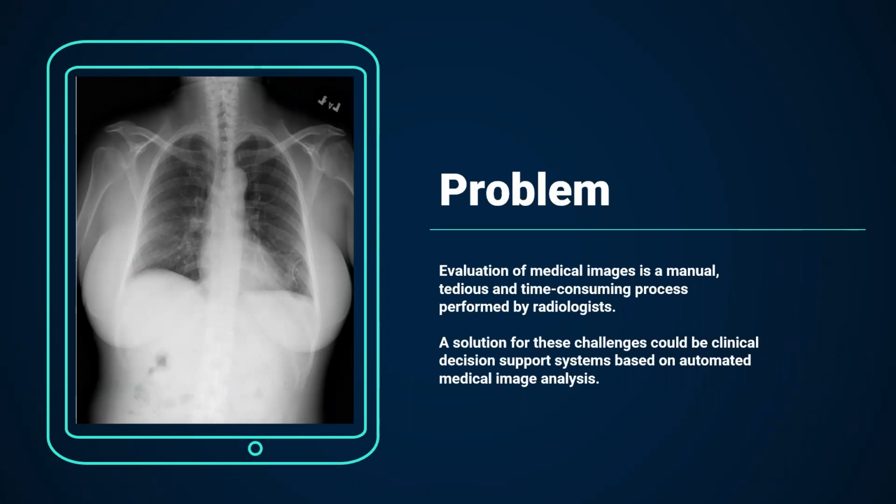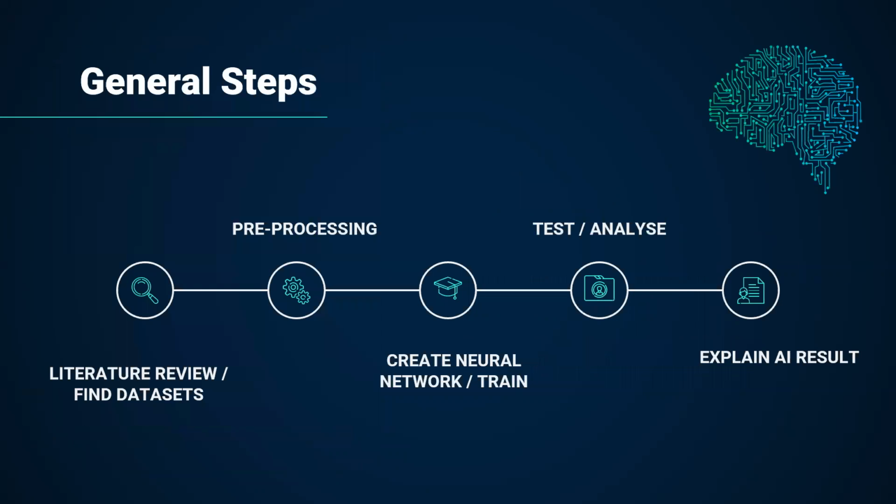Although early diagnosis is possible by doctors using CXR, it's a great burden for them to evaluate these CXRs from scratch because it's time-consuming and labor-intensive. Thus, the availability of expert radiologists, especially in low-income countries, makes early diagnosis inaccessible. In order to avoid this, CAD systems can help novice doctors to navigate and have some insights from X-ray images. In this work, we investigated pneumonia detection in chest X-ray images.